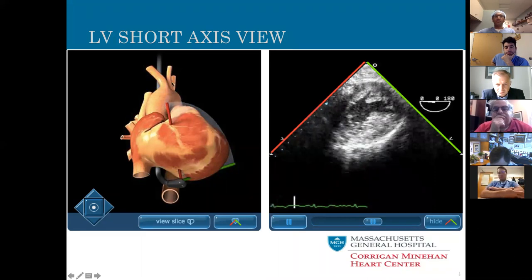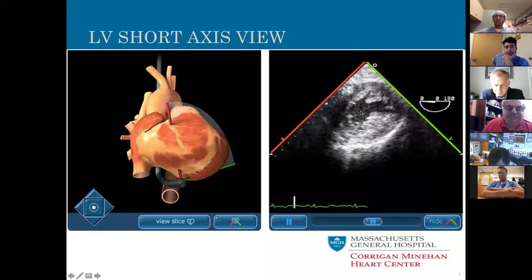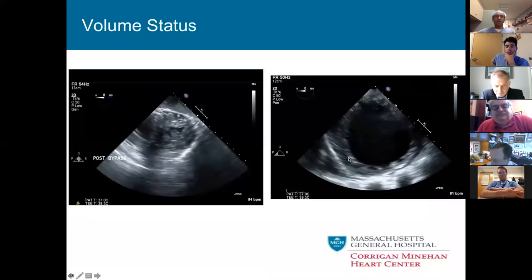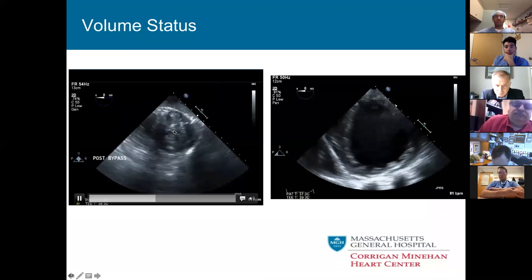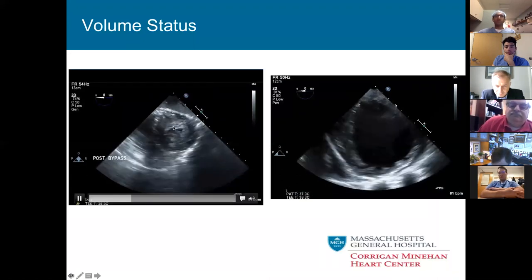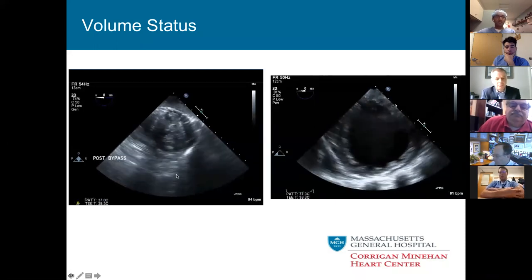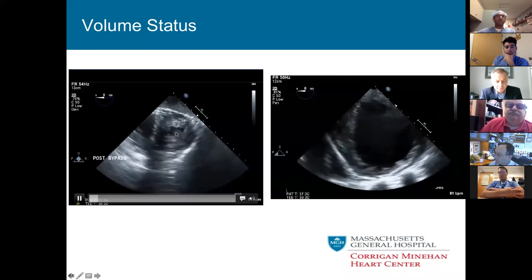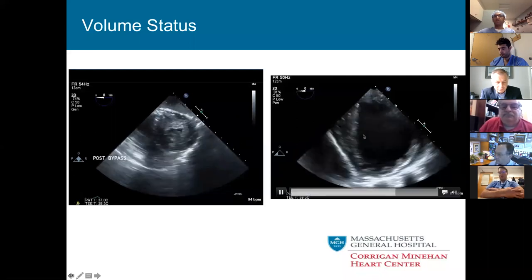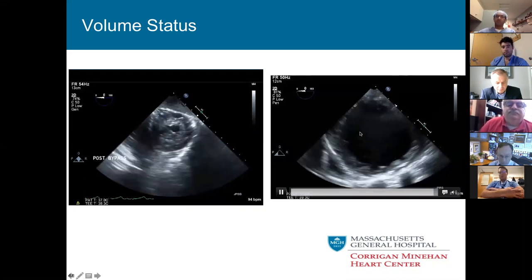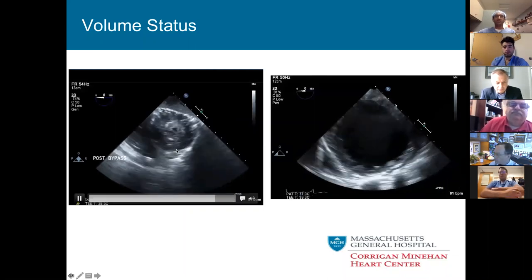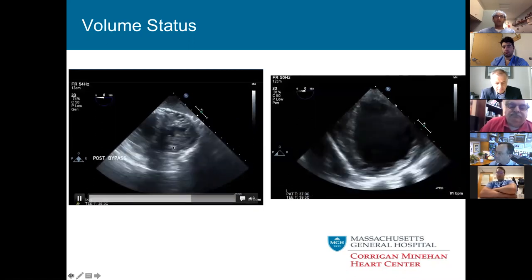In the LV short axis view, the TEE probe is positioned right on the left ventricle giving beautiful images. You can look at the cavity size and it directly guides management. Early post-bypass: if the LV cavity is completely empty, the patient needs volume — not inotropes. In the contrasting case: a lot of volume but very poor function — that patient doesn't need more volume, they need inotropes. Looking at just the LV in the ICU or early post-bypass gives you a clear clue about the management strategy.